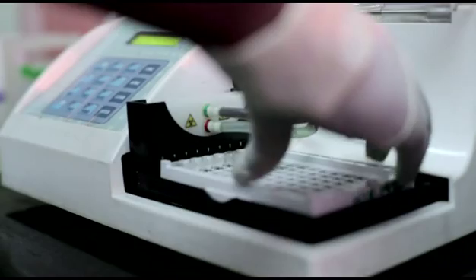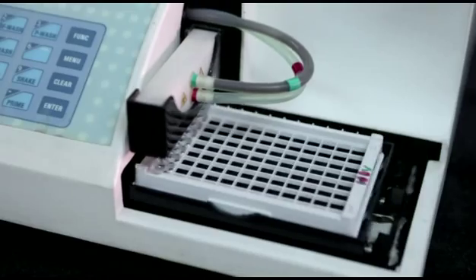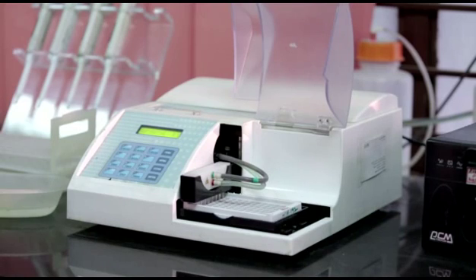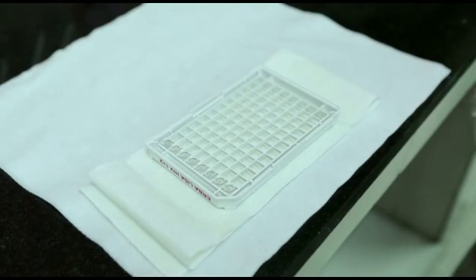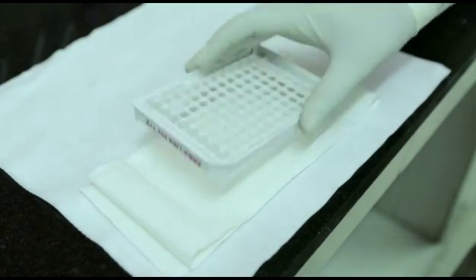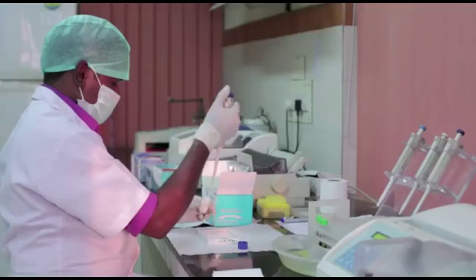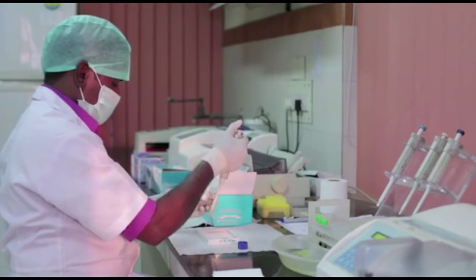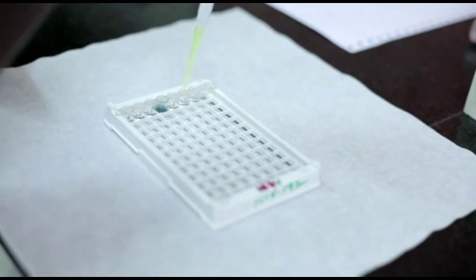Now wash the microplate using ELISA washer as per kit literature. Invert the plate over a tissue paper and dry it by gently tapping. Then add enzyme conjugate and incubate again. Repeat the washing step. Meanwhile, prepare the enzyme substrate and keep it ready. Dry the microplate and add enzyme substrate to the wells as per instructions.